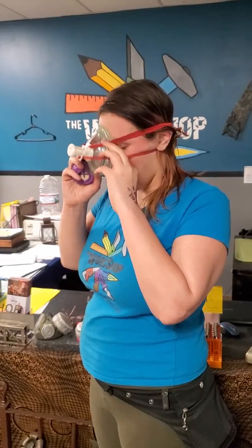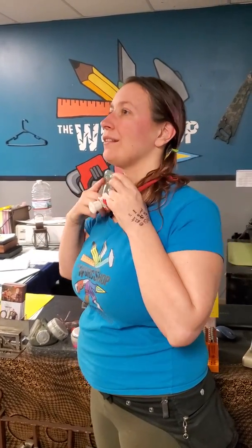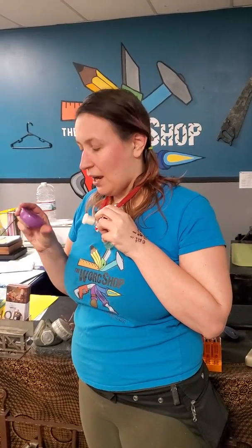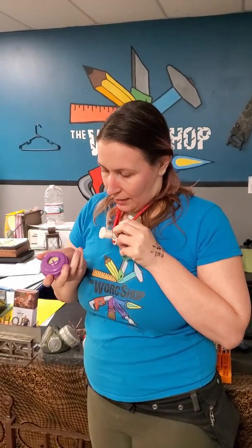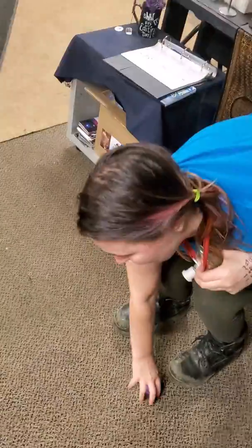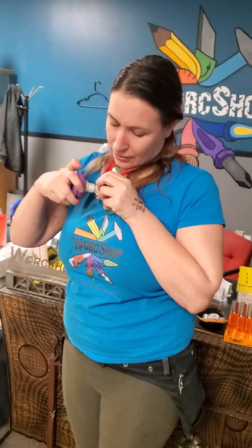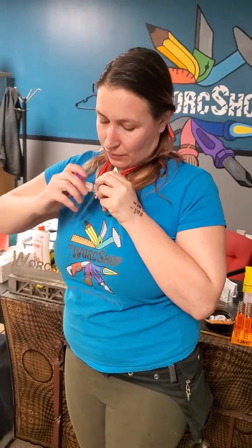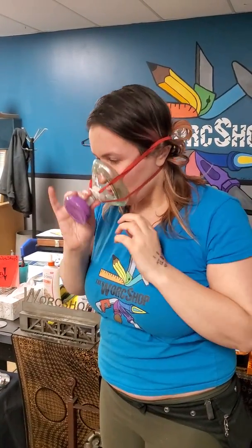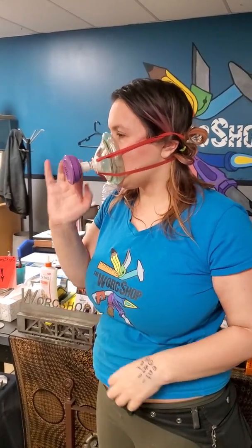We've come up with, and are working on, a couple of different ends to fit various filters. This one fits a Honeywell North P100 filter, which has a threaded back. So this particular adapter for our Honeywell filter will thread right on in there, and it's actually pretty secure with a nice tight feel.